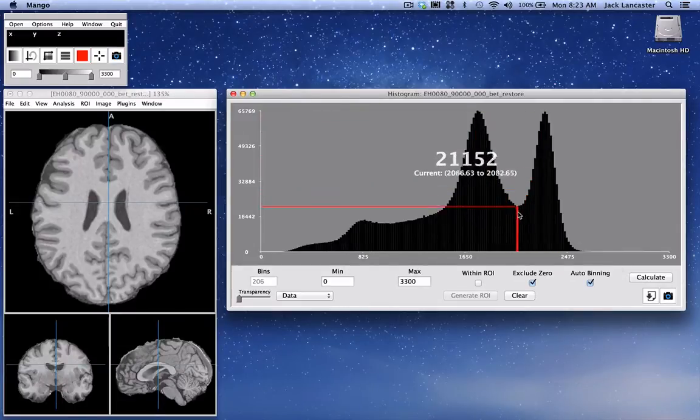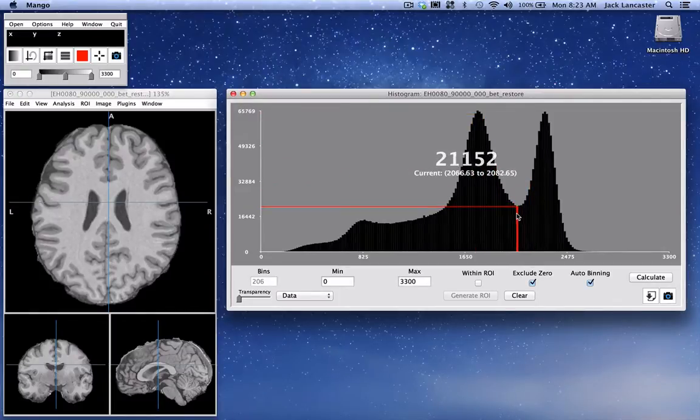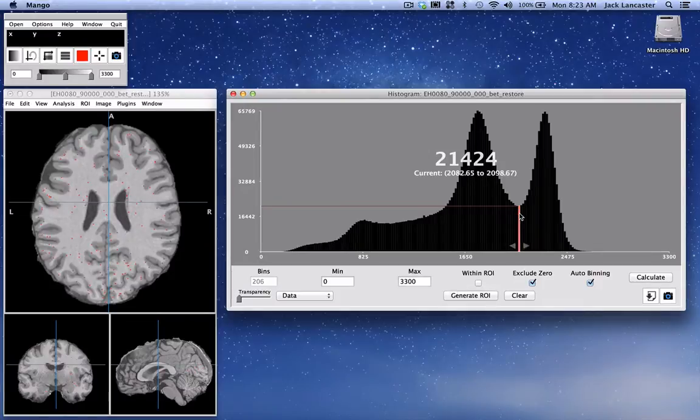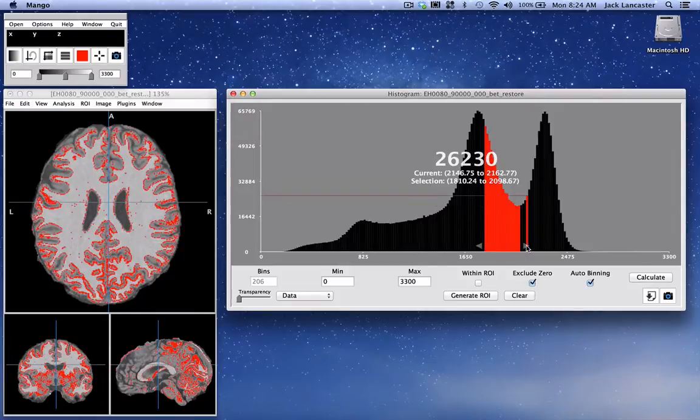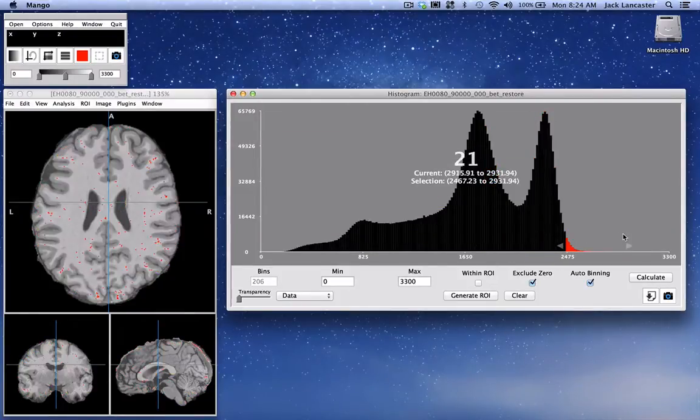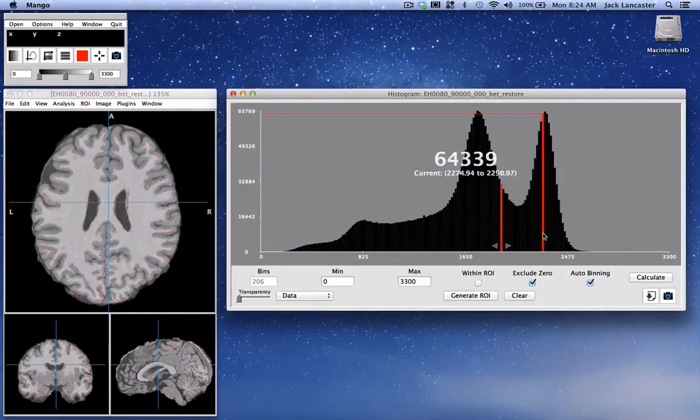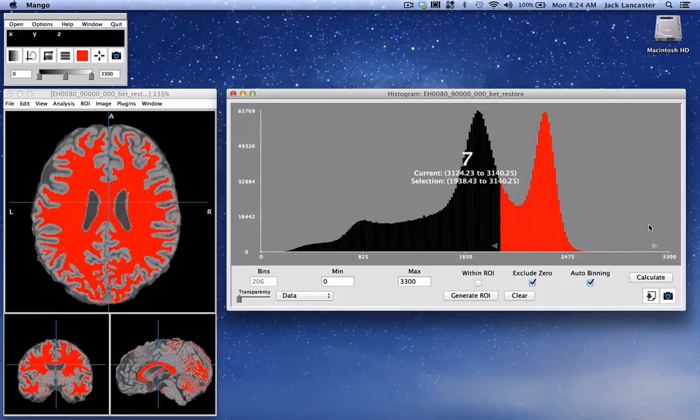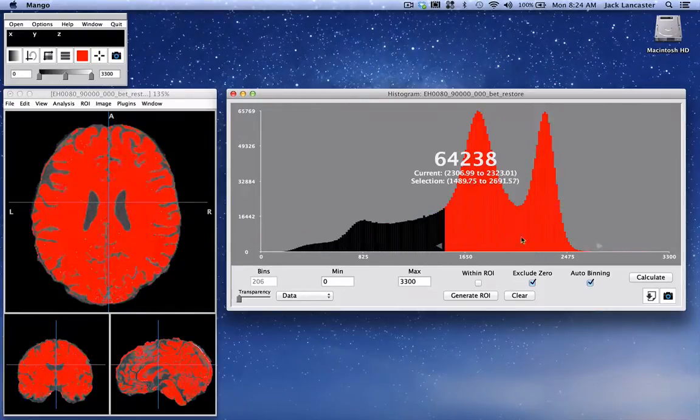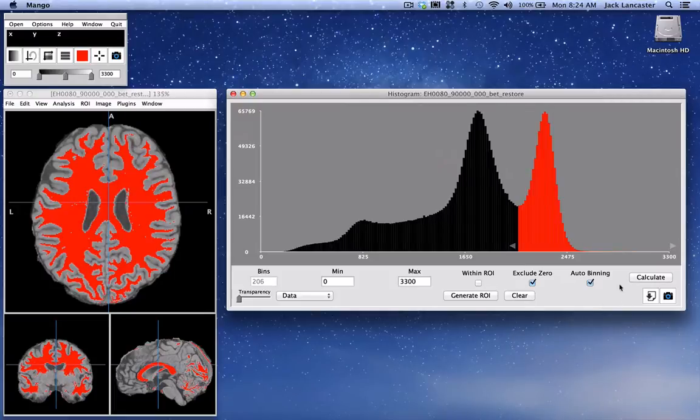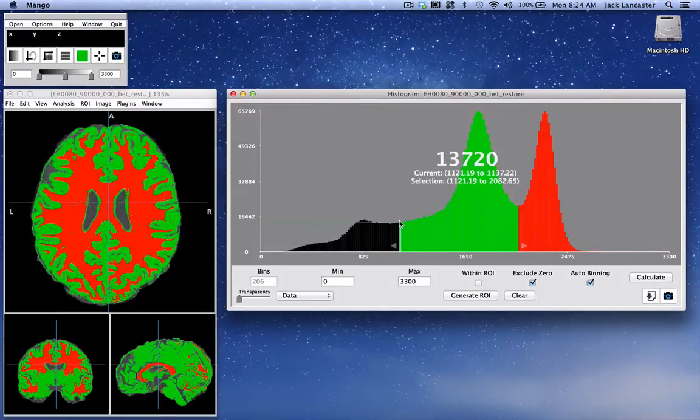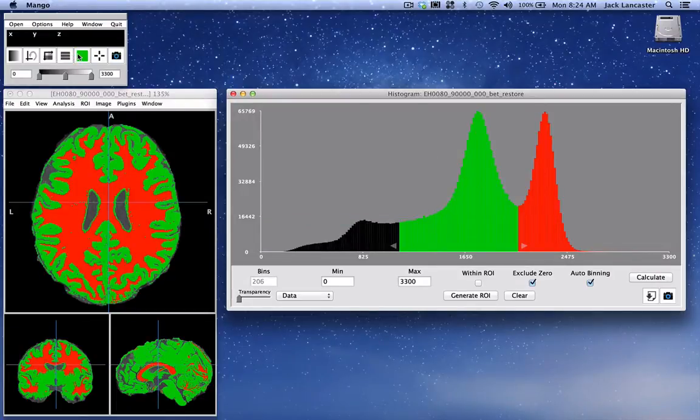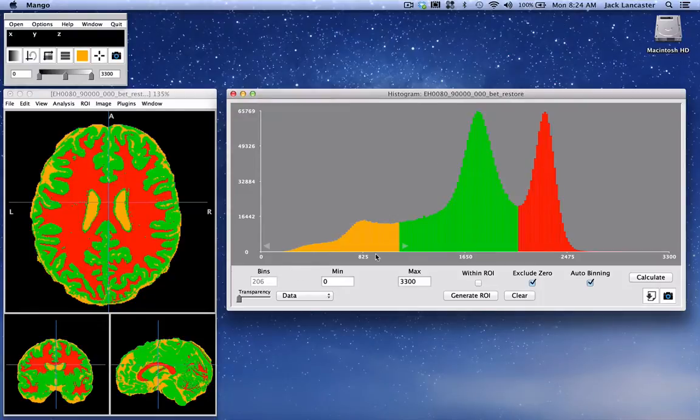As we move back and forth the histogram hasn't changed particularly until you select a point or anchor it. Notice now we have little grabbers on each end so that we can adjust the range in this fashion. We can extend the range in a similar way. We're going to select this range as red and notice there's no color icon here anymore. The color icon is the system color icon now to be consistent across all of our applications. We'll select that as green, that's roughly gray matter, and we'll skip over here to this gold looking color.